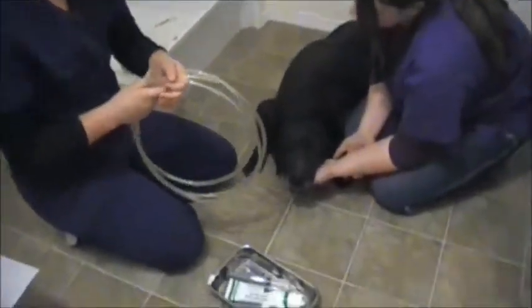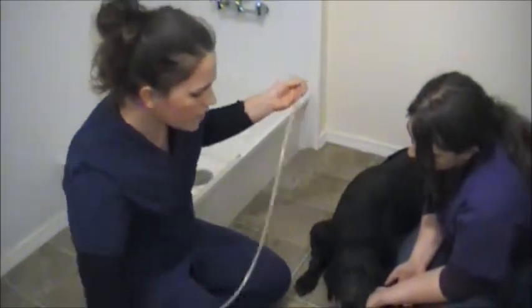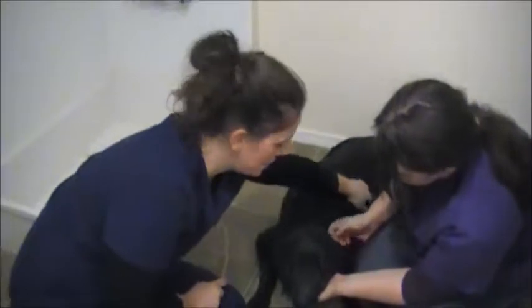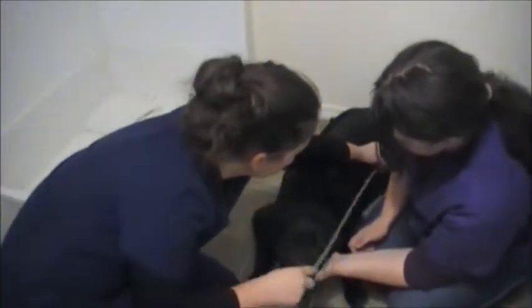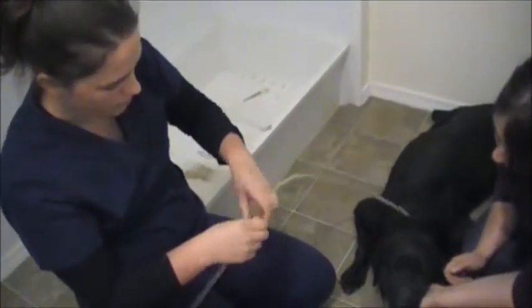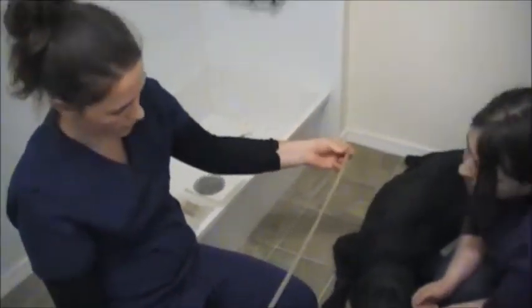So first thing I'm going to do is measure the length of the tube so I know how much I can place into this dog's stomach. When I'm measuring for my tube, I'm measuring from the canine tooth to the last rib, and that's going to give me the length I need for my tube. So I can feel the last rib right here, measuring up to the canine tooth right here. And then I'm just going to mark off so I know how far to place the tube. Okay, so that gives me how much I need.